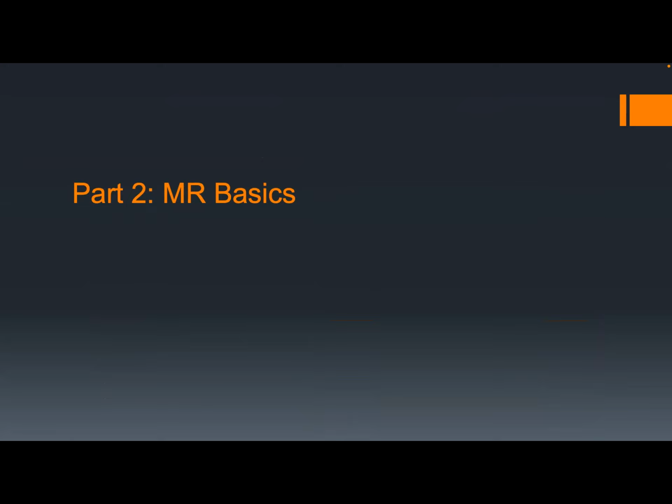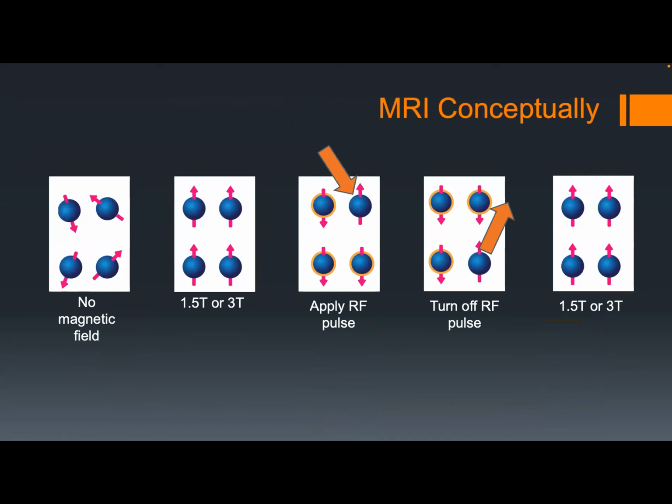So for an exceptionally simplified comment on the MR sequences that we're using, we're going to talk about MR basics. Conceptually, this is how I think of MR image acquisition and how it works. It works for people who don't have as much experience with MR. I have a lot of it, but this is how I explain it to trainees and also to non-MR focused radiologists.